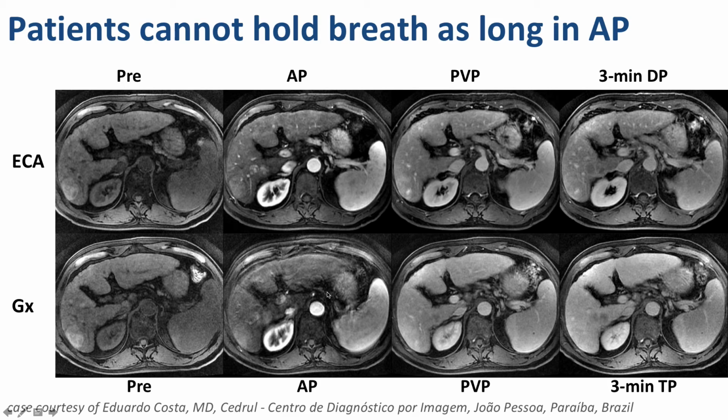And we think that Gadoxetate basically reduces everyone's comfortable breath hold capacity by maybe 10 or 15 seconds. So if you can hold your breath for a minute and you take Gadoxetate, you're only able to hold your breath for about 45 seconds. Does that matter clinically if you're doing an MRI? Of course not, because we never do 45-second breath holds. But what if you can hold your breath for 25 seconds and I give you Gadoxetate and then you can only hold your breath for 10 seconds and your sequence is 15 seconds long? Then you're going to have motion artifacts.